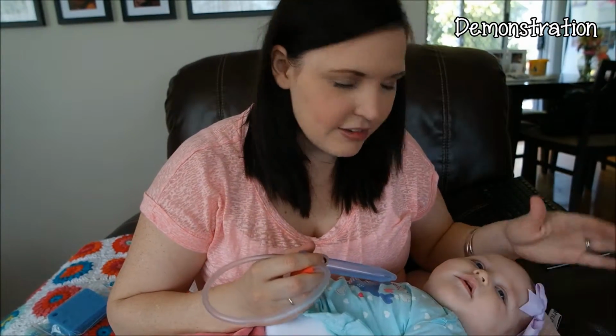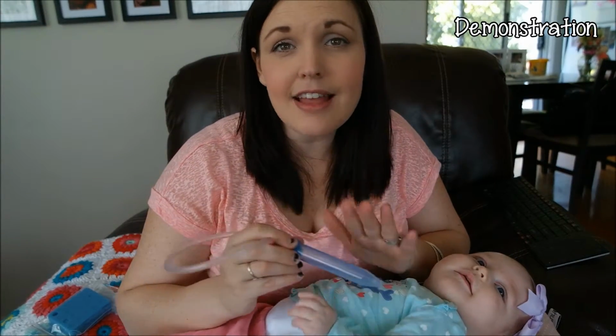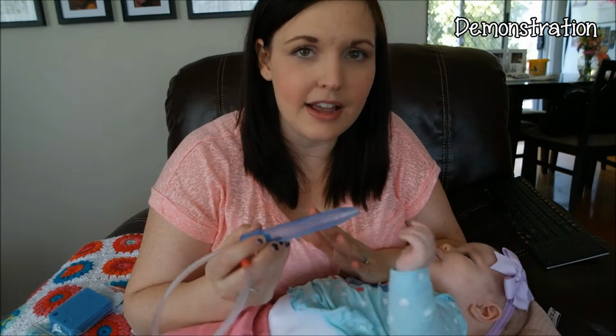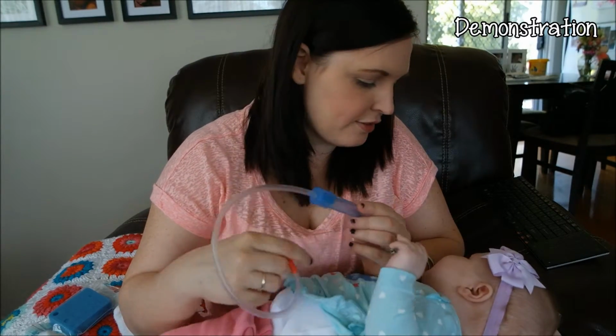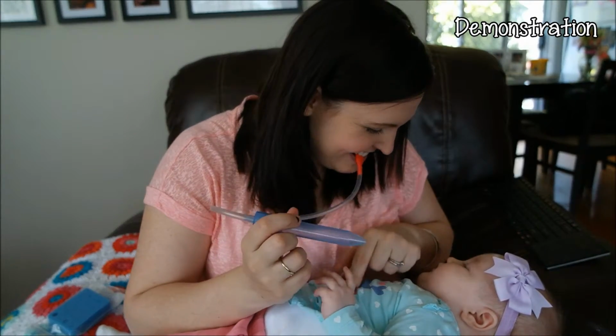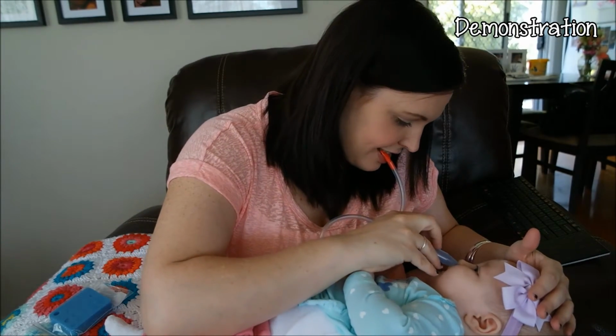So now that Lillia's laying nice and comfy, hey Lillia, we got to make sure that her head stays nice and still and doesn't move around too much, so it doesn't hurt her very much. Now apparently you can't suck too hard on this, so it doesn't matter how hard you suck it, you can't get it to suck too hard for her. So I'll give you a little demonstration. Hey baby girl. So this little bit just goes into her nostril, like so.